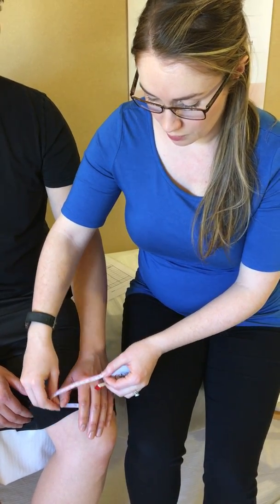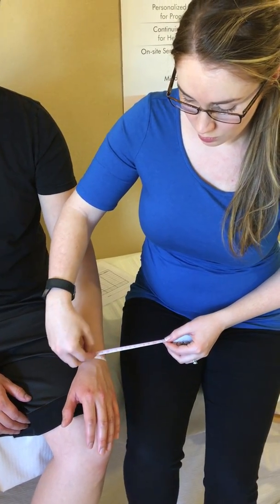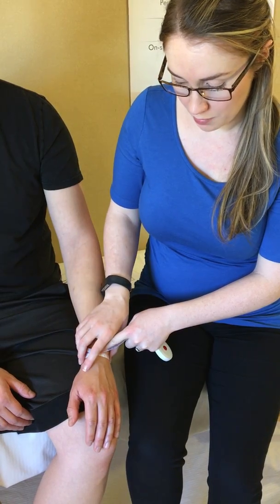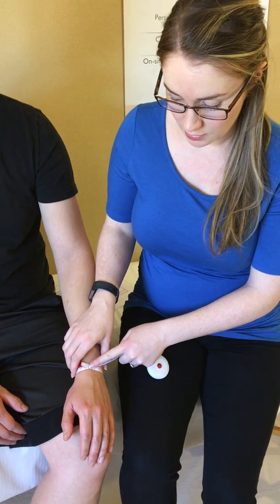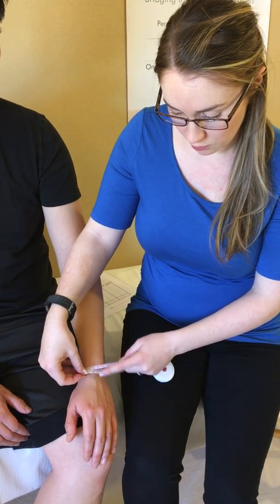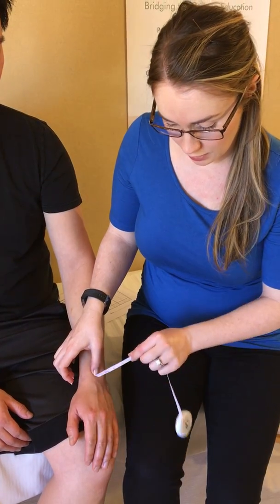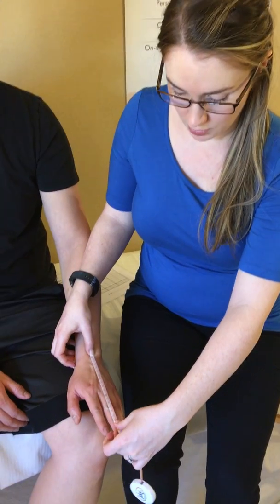Our next measurement will be the wrist. When you're measuring the wrist, you want to try and measure across the bony prominences of the wrist. This can sometimes be hard to palpate in your patients who have a lot of swelling. If you're worried about having consistency in your measurement, what you can always do is take your measurement at the wrist and then also measure how far your measurement was from the next anatomical landmark, such as the MCP or the top of the finger.